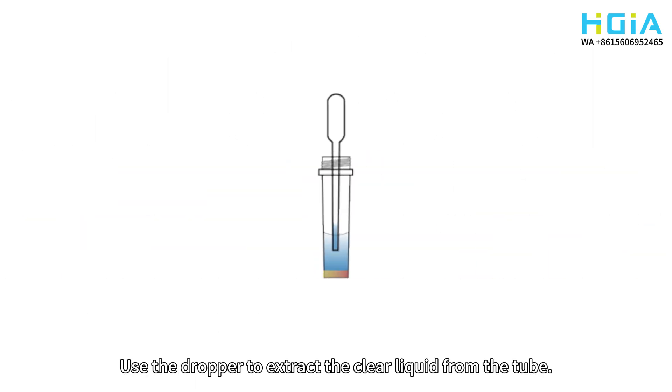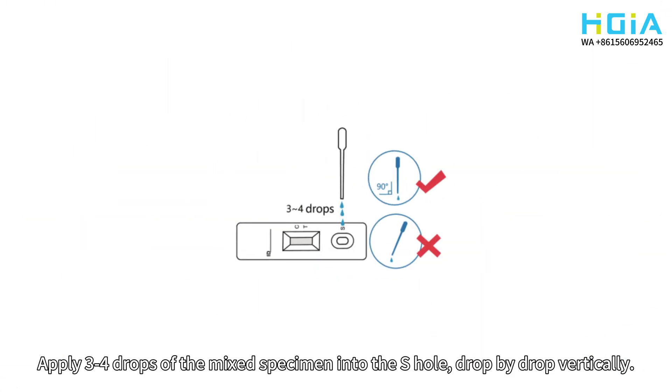Use the dropper to extract the clear liquid from the tube. Apply three to four drops of the mixed specimen into the S hole, drop by drop vertically.